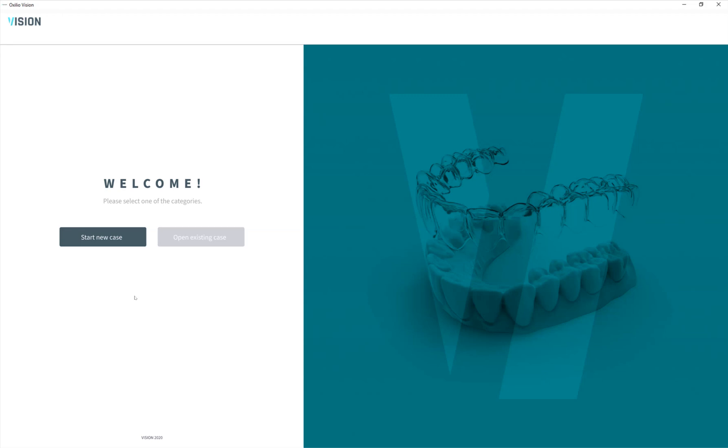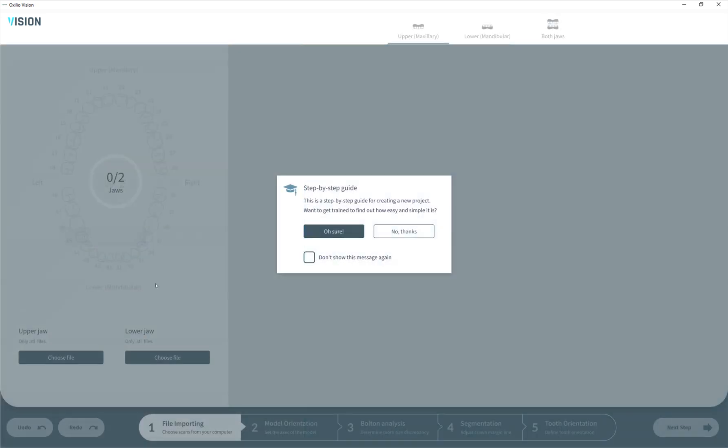Hello my dear friends, let's start. Here's the welcome page where we can start a new case or open an existing one. First of all, we can see the step-by-step guide that will help us understand how to navigate through the software and what buttons mean.